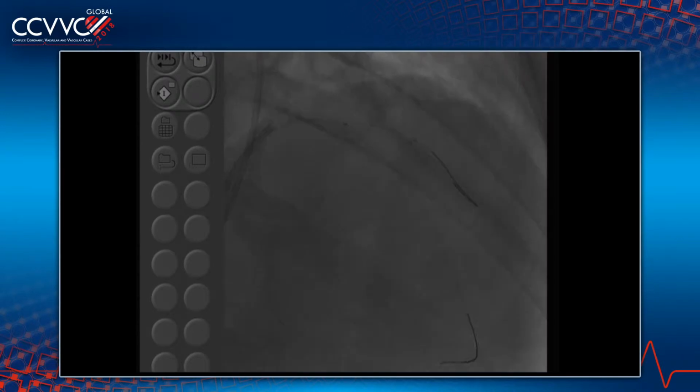With the structural program, for a lot of caths prior to TAVR in elderly folks, we'll do left radial. Certainly if they're short stature. And of course, if it's a post-bypass patient with a left in situ left mammary graft. Again, we'll always evaluate both pulses, so that might inform the decision as well. But just from our custom, we prefer the right radial. There is slightly more radiation, obviously, with the right radial, but operator comfort is greater.